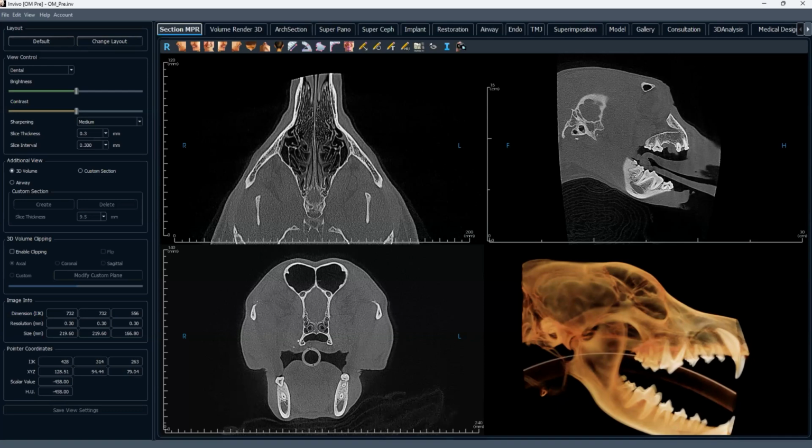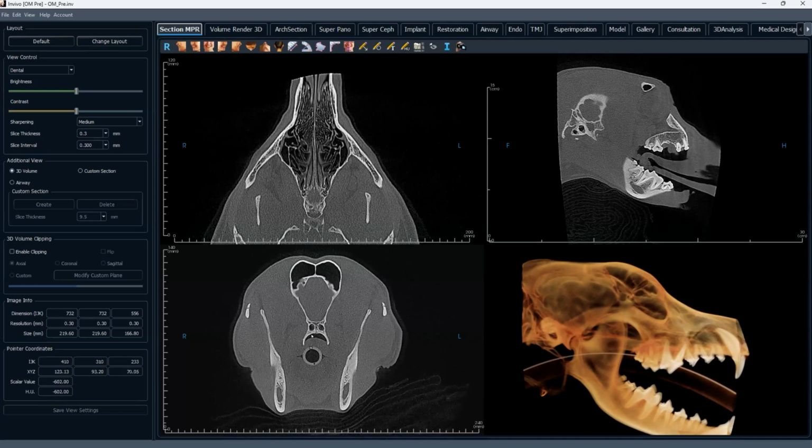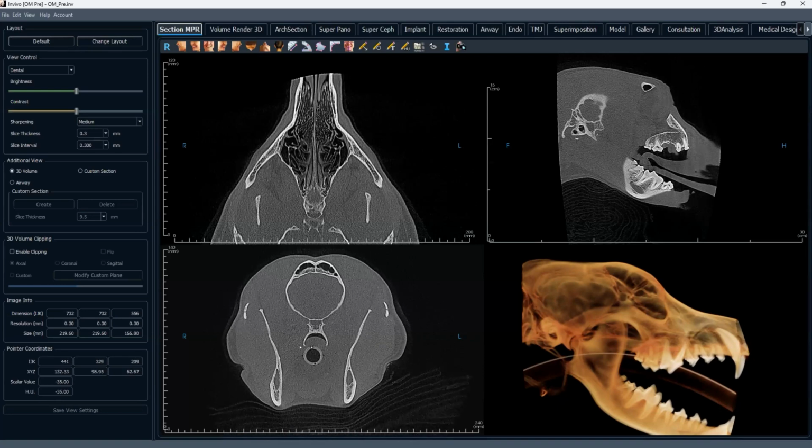So just to make sure we got all the way back, we went back and used the piezotome to go underneath and make a horizontal cut to make sure that we got as much of the palatine bone as possible, all the way back to the beginning of the pterygoid bone, to make sure that we got that whole shelf with all those bony changes. And that actually worked out pretty well.